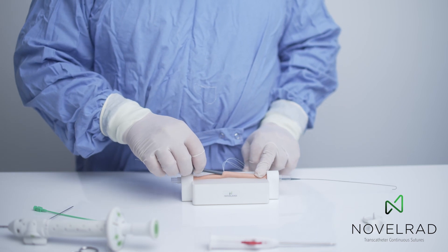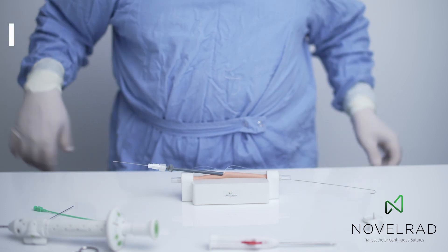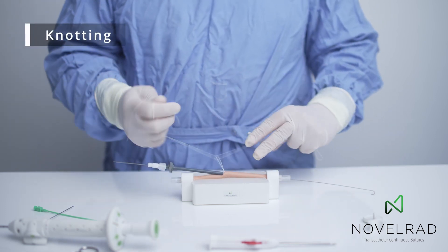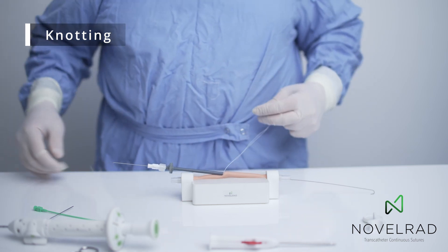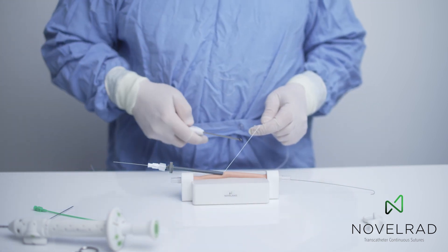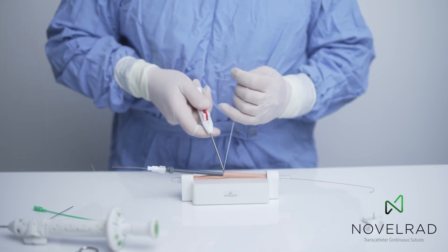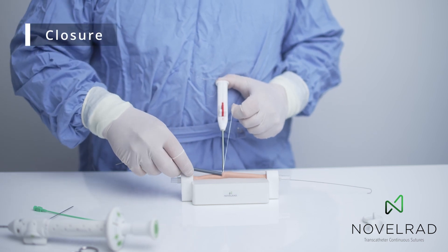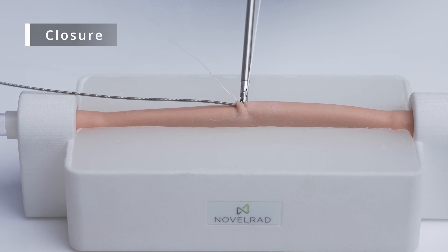So now we've finished the procedure with our 14 French sheath. We can take the sutures, perform a sliding knot by standard procedure, and the knot slides down. Then taking our knot pusher and suture knife so that it'll cut the suture. You can put tension on the suture very nicely, and we take out the 14 French system and then close the suture.